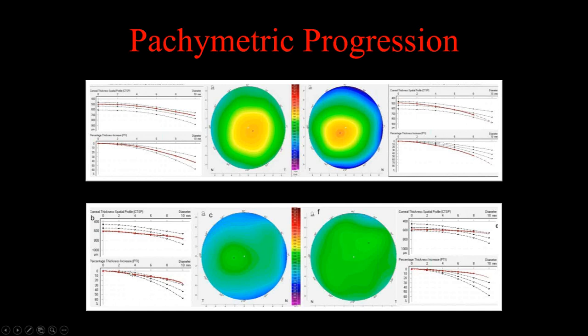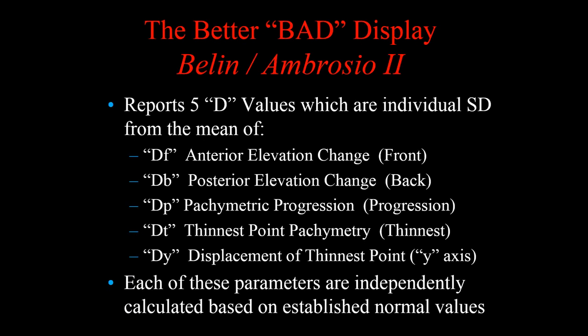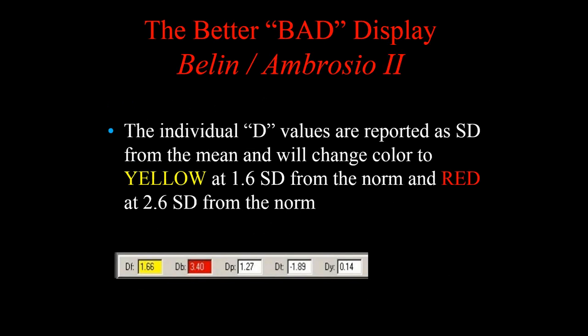Here there is still change, but notice the tracing is above. When you see these types of tracings, you really should look closely at the endothelium in that patient. I'm going to skip by some of these slides just for reasons of time.